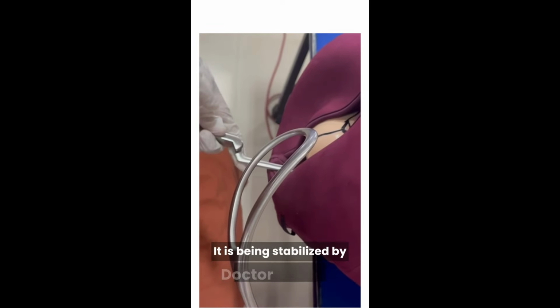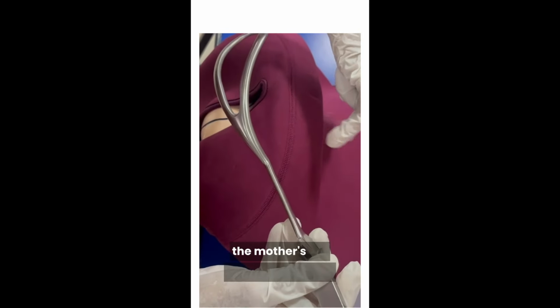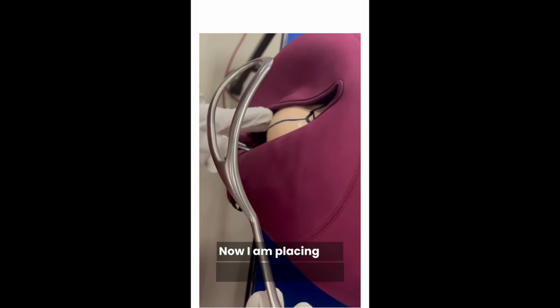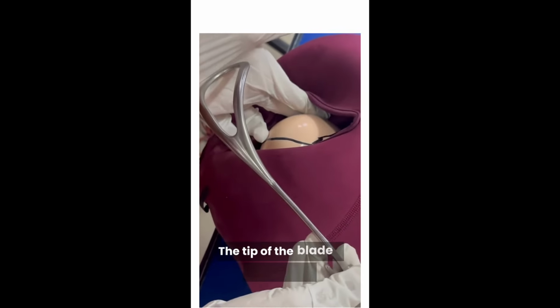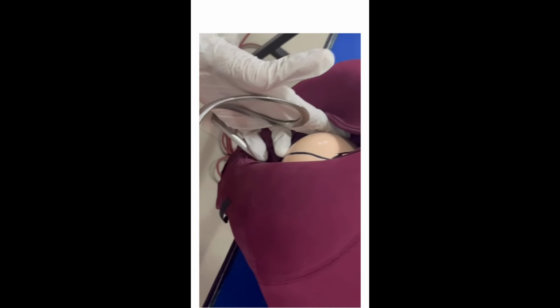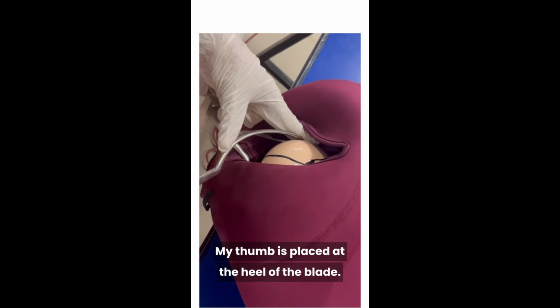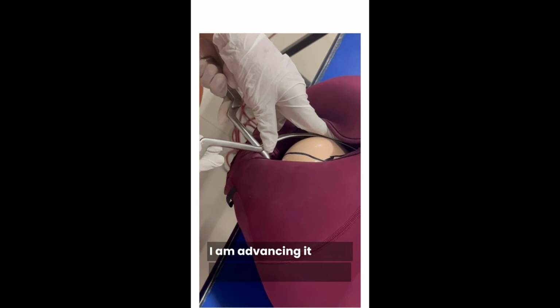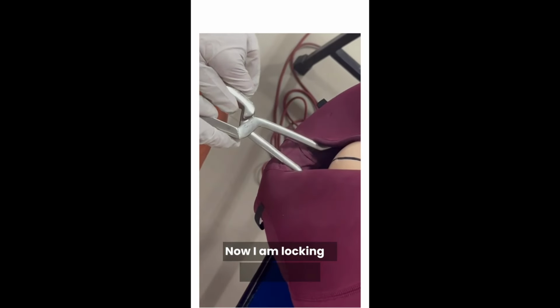Right blade of the forceps. The left blade is already in. It is being stabilized by Dr. Ramya. Now I am holding the right blade with my right hand. The shank is parallel to the mother's left inguinal ligament. Now I am placing my fingers in the vagina, occupying the right lateral quadrant of the maternal pelvis. The tip of the blade is now resting in the palm of my left hand. I am sliding it. Now my thumb is placed at the heel of the blade. I am advancing it till the whole blade is inserted. I remove my guiding fingers now. I am locking it successfully.